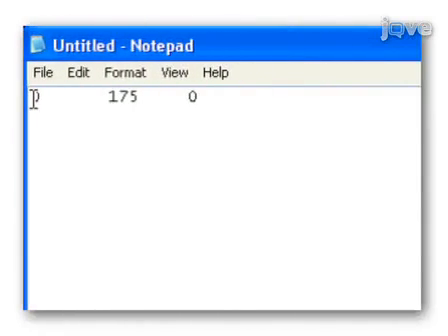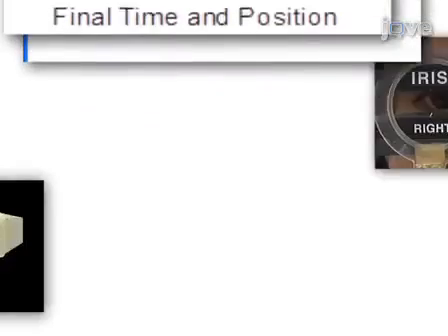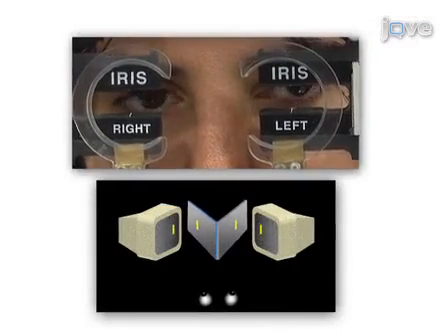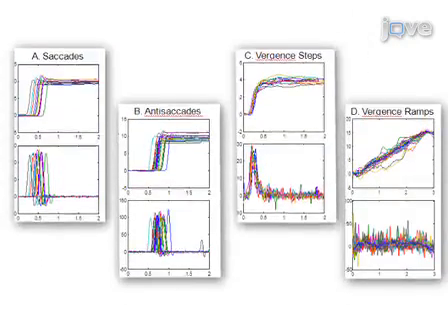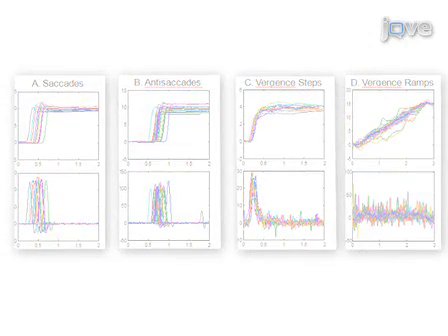The second step is to define the initial and final positions of the left and right eye stimuli by saving the stimuli into a library prior to the experimental session. And finally, the eye movement monitor is placed on the subject and the experimental script is run to record eye movement responses. Ultimately, results can be obtained that show position and velocity traces of eye movements.